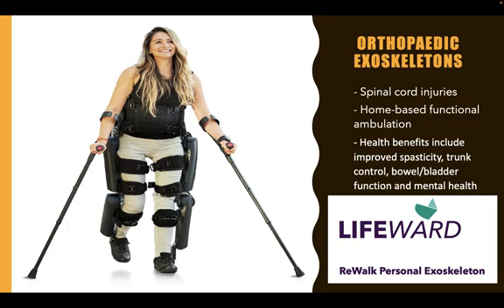This is also very consultant-led and is not usually for trainees to learn on until they are competent and can demonstrate to their trainers that they're able to do a joint replacement manually and conventionally. There's also more and more machinery in pedicle screw insertions for spine surgery too.